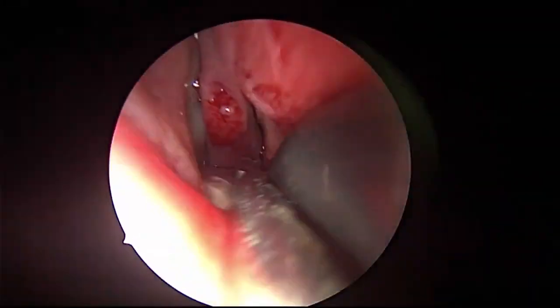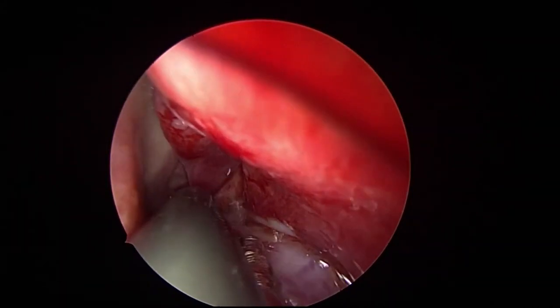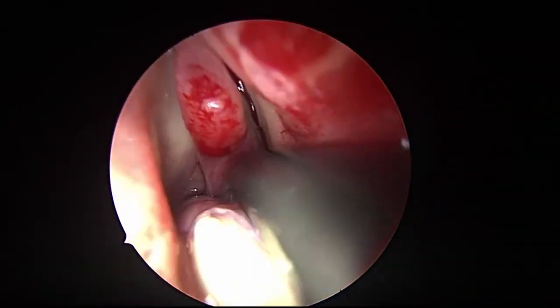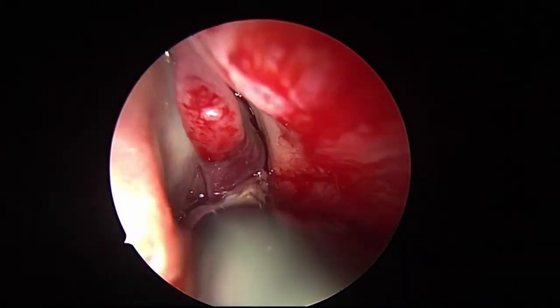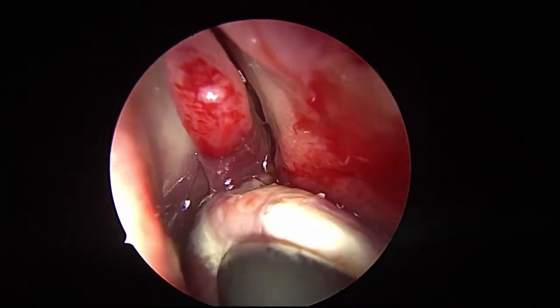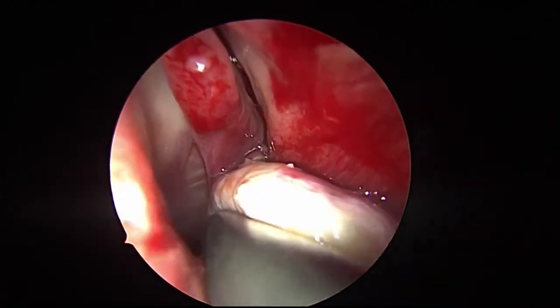Now my man of the match during the entire surgery is going to be the coblator, for reasons we'll discuss again and again. I told you the biggest source of bleeding is arterial, though there are other sources also, venous and all that, and major from the external carotid branches.